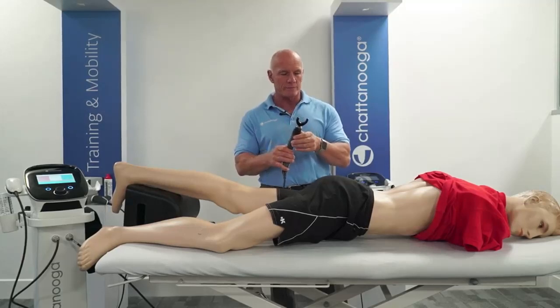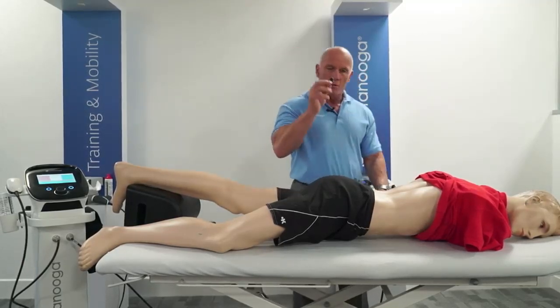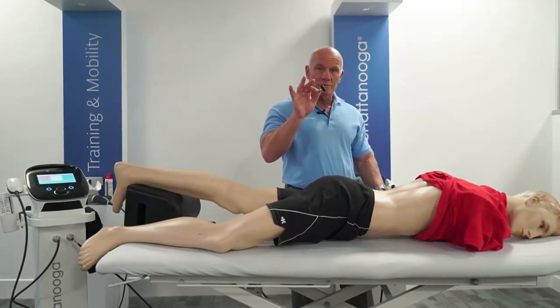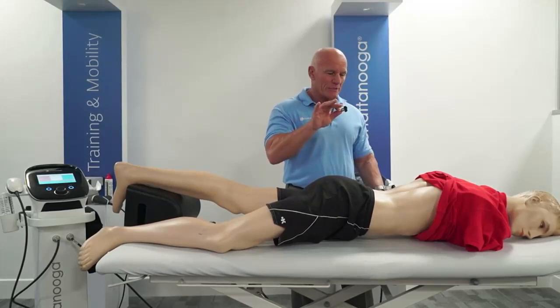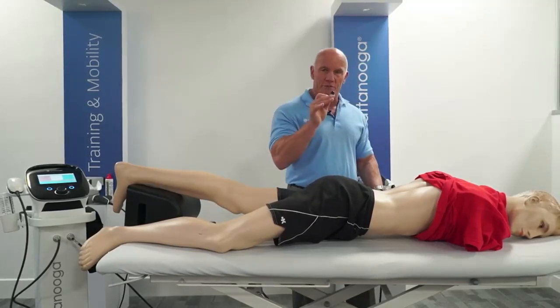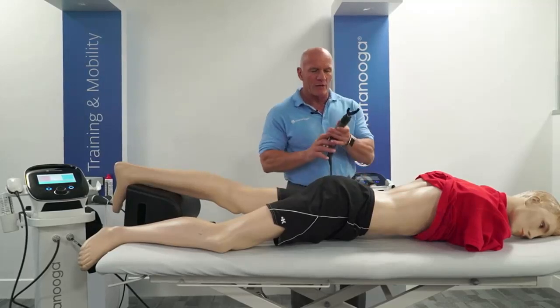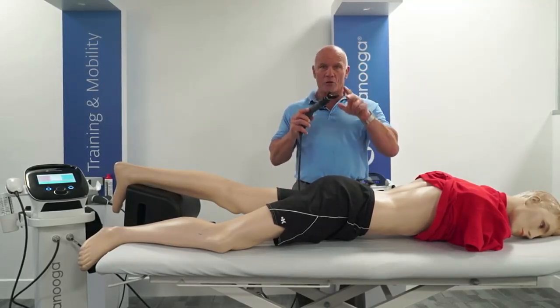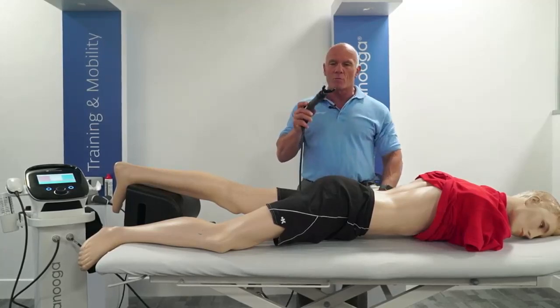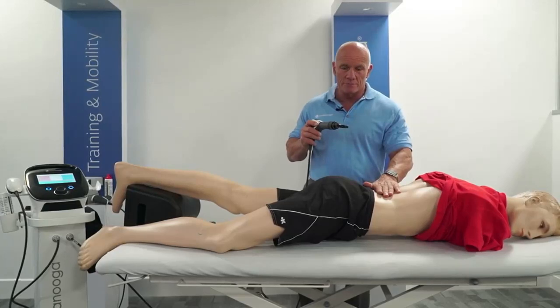Now, with the fascia and the scraper, we don't use gel because we're not trying to transmit a radial pressure wave into the tissue. Remember, we want this to glide. However, we do want to provide a shock wave or radial pressure wave with this transmitter, so we do use gel. And why is it shaped like this?